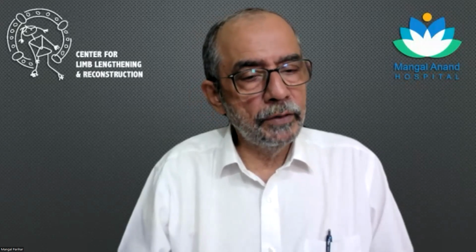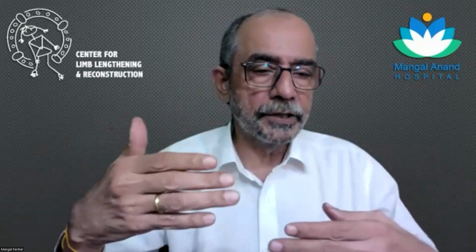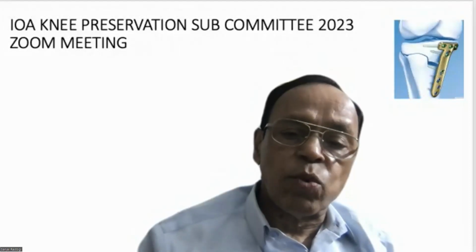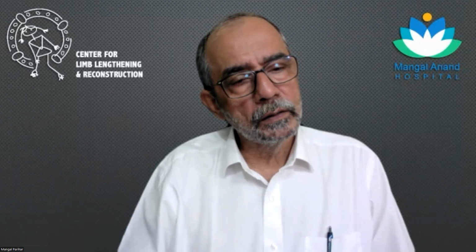So distal release will work, but if you're doing a large correction, then sometimes you need further release of it. You've done the distal release, you've done the correction, and then you put the plate in, and then when I put my finger inside, the tendon is really stretched against my finger. Then I will do a pie crusting. And you put the plate under the MCL or over it? Proximally it is under, and distally it is over.